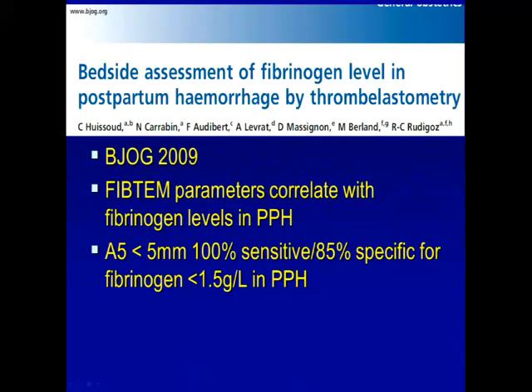So I was talking to the team in Kelowna, and they are switching over from TEG to ROTEM. ROTEM has done a really aggressive push in North America. Being a German company, they're very insightful in realizing that we're making a shift away from cryo to more fibrinogen concentrate, targeted therapy, and Octaplex versus plasma. Those are all German products. This is a German machine that you sort of need to use for the German products.